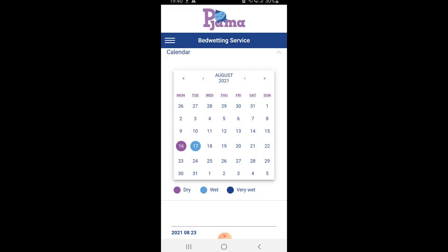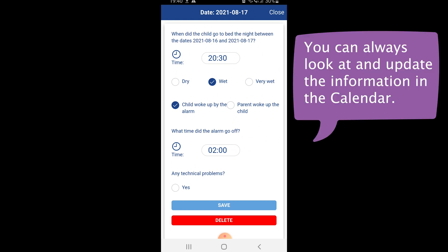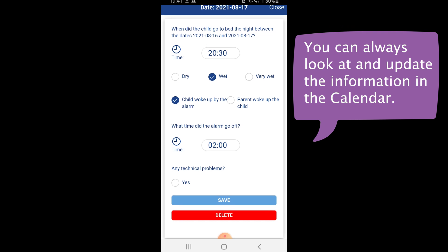You can always go back and look at the calendar entry. Notice that if you have a phone or tablet with the Pyjama application within 10 meters from a Pyjama sensor, the time of the bedwetting alarm is automatically updated to the correct time, which simplifies the calendar entry.